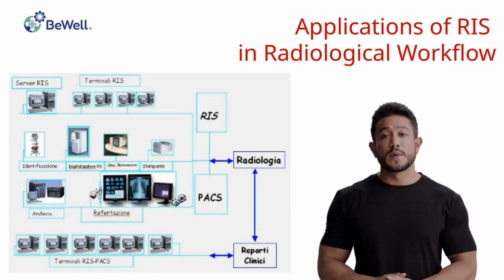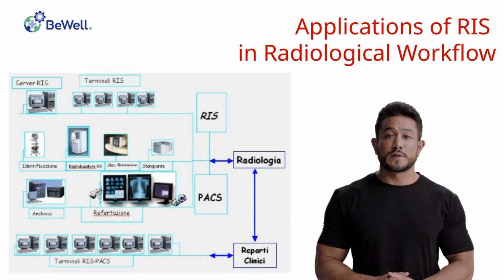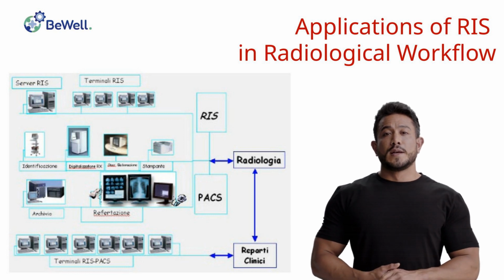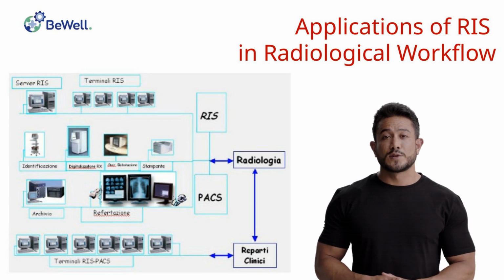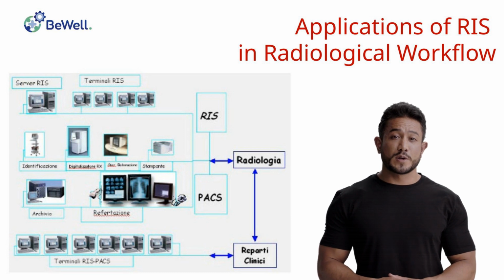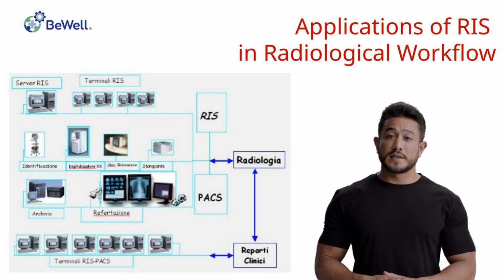Radiology scheduling. The next phase managed by the RIS is updating the radiology schedule based on the available resources such as rooms, equipment, and personnel. The RIS searches the central server's archive for any previous data related to the patient, appointments, admissions, reports to detect incompatibilities between examinations or to indicate the completion of the requested examination.